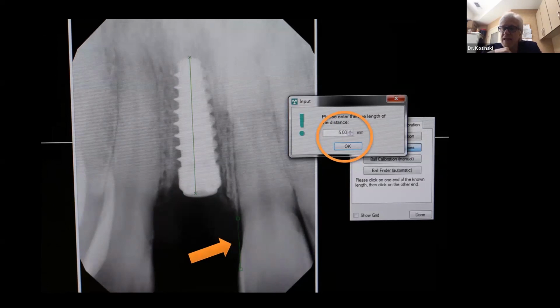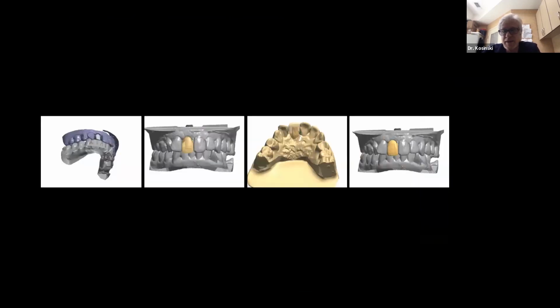The distal aspect, you can see that interseptal bone is blunted. I didn't do it. That tooth, the lateral incisor, is malpositioned. So I don't expect to get a good interdental papilla in that area. But in the mesial, right in the front of the mouth, I expect to get a good result. Let's see if we did.